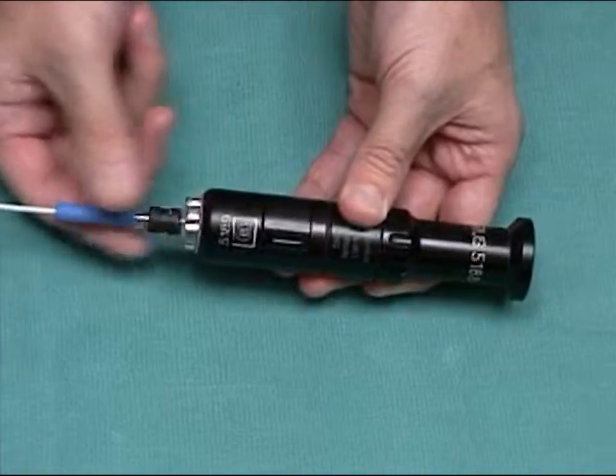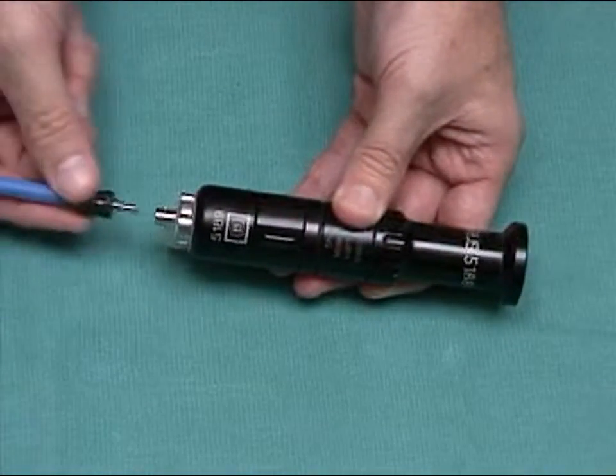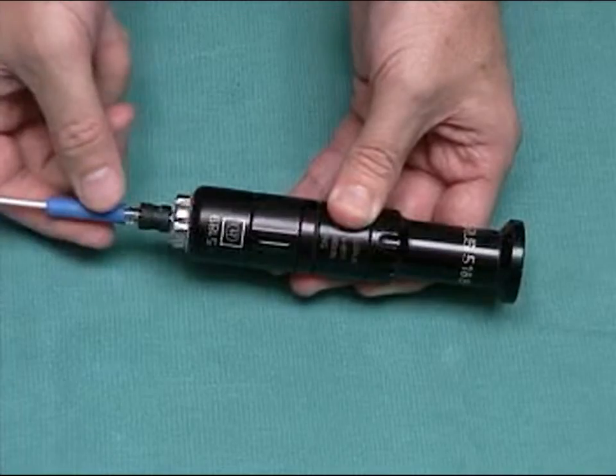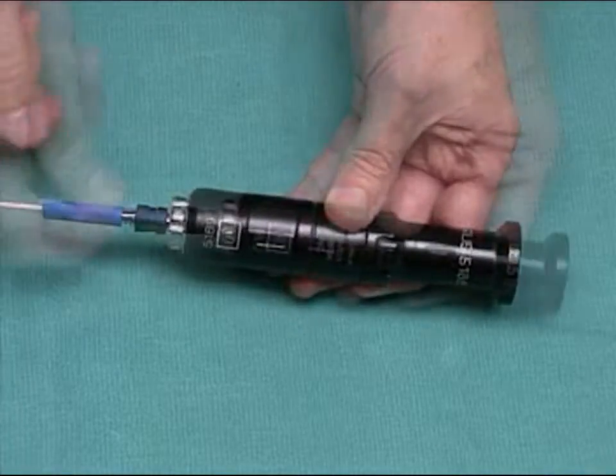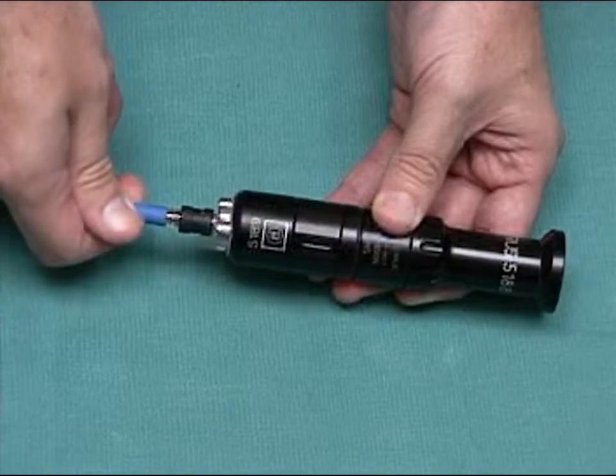Align the pins on the LASE image connector, push, twist clockwise, and it's on. Tug to test that it's securely attached. If you wish, rotate the image connector to orient the image.